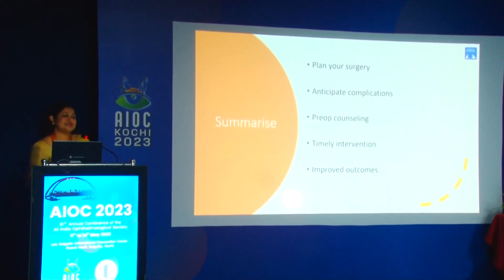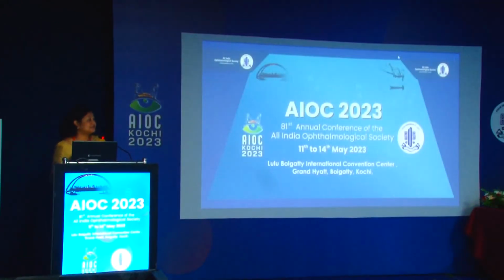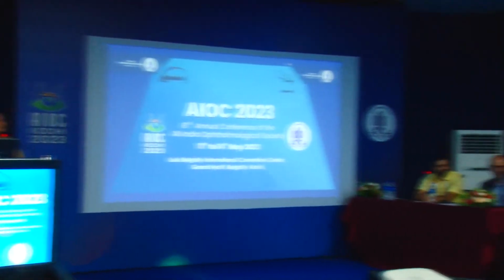Any questions? Ma'am, which suture do you use to secure the temporary KPro? 7-0 Vicryl. For your sclerocorneal graft, you're using 8-0? 9-0. 9-0. Very nice talk.